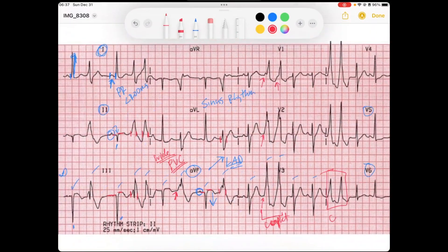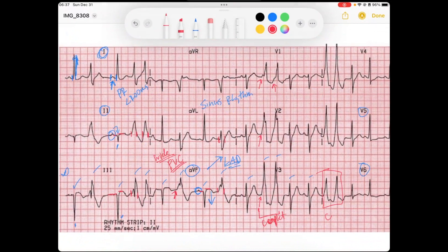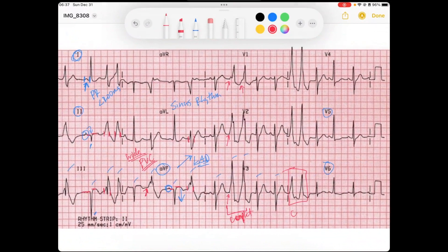We're also starting to see some reciprocal changes — there appears to be ST depression in V5 and ST depression in V4.